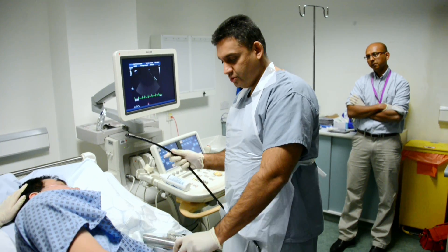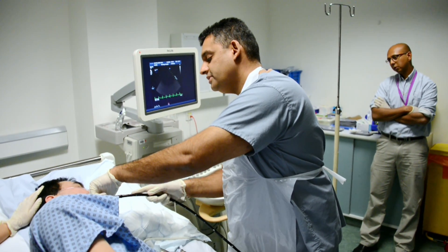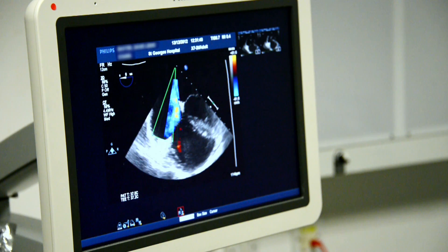I then talk to the patient as I put the probe down, because he's still relatively awake. Close your eyes and I'll talk you through it, okay? It's now in the right position. The point that I ask him to swallow — you can see the probe coming down and I can see the picture appear on the machine. Okay, the probe's in, David. I can see your heart as we speak now.